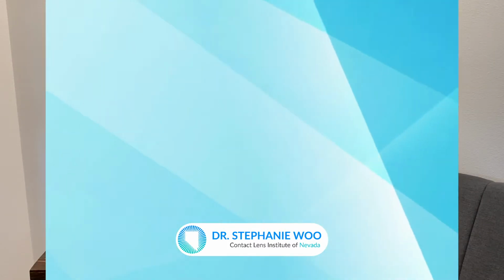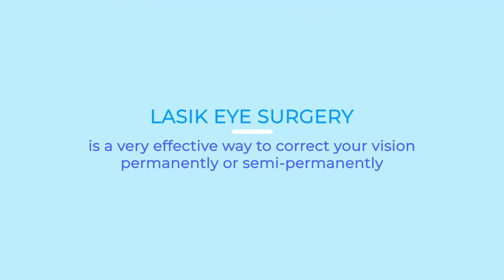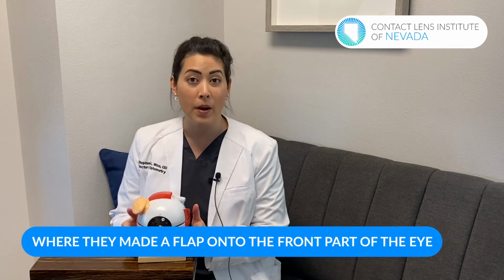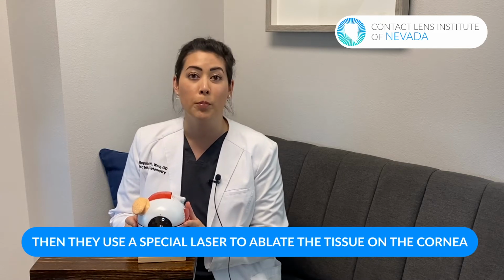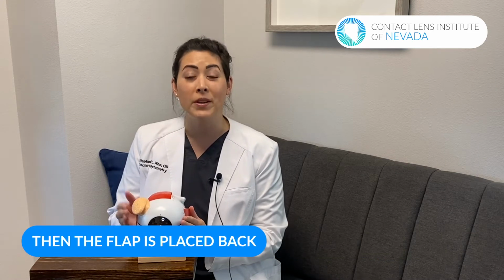Today we're going to be talking about what it's like to get LASIK and what you need to know. LASIK eye surgery has been around for quite some time, and the doctors and the equipment manufacturers have really perfected this surgery. It is a very, very effective way to correct your vision permanently or semi-permanently. LASIK is a laser eye surgery where they make a flap on the front part of the eye, and then they use a special laser to ablate the tissue on the cornea, the front part of the eye, and then the flap is placed back.